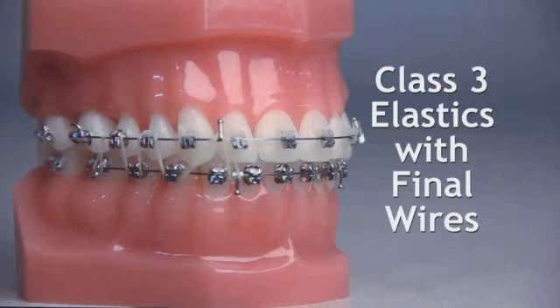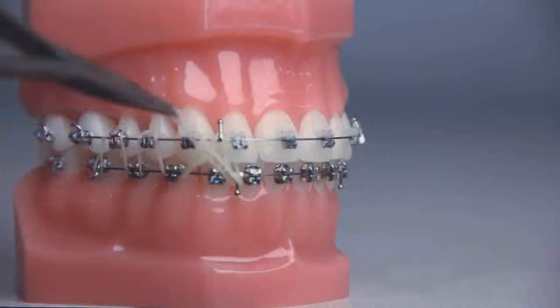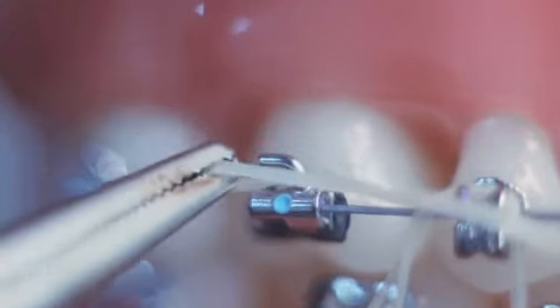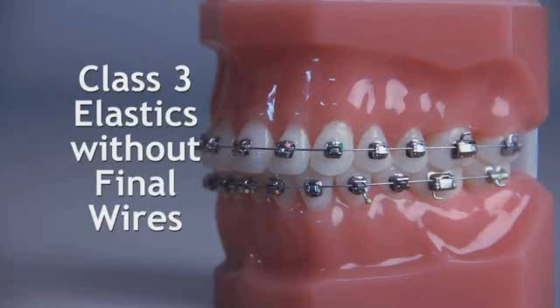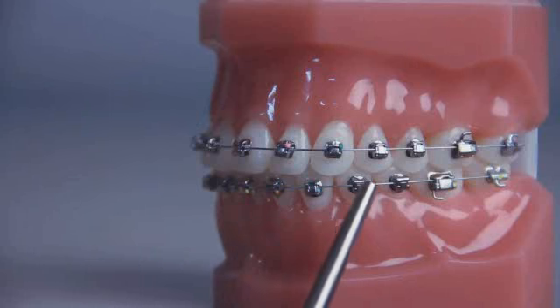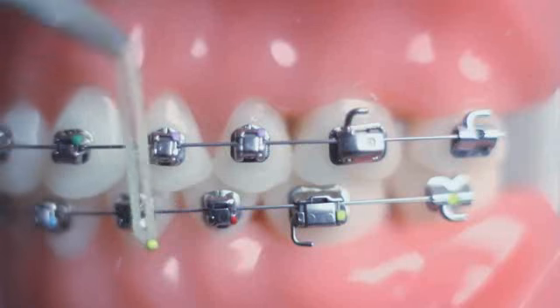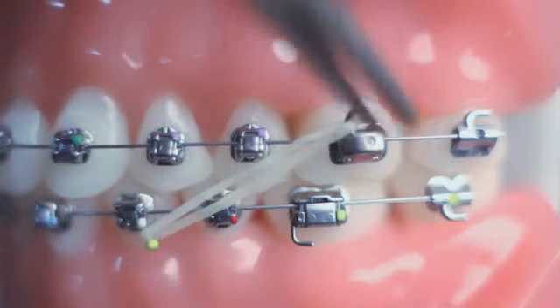For Class 3 elastics, if your final wires are in, hook the rubber band around the hook attached to the wire on the bottom and go diagonally back to the second to last tooth on top. If your final wires aren't in yet, hook the rubber band around the hook in the 4th bracket back from the center tooth on bottom. Then place it diagonally back to the second to last tooth on top.